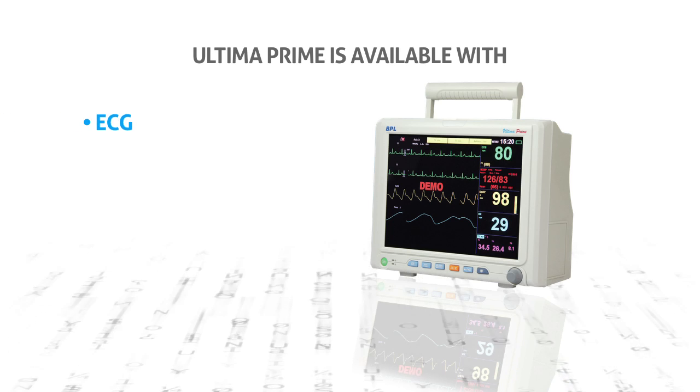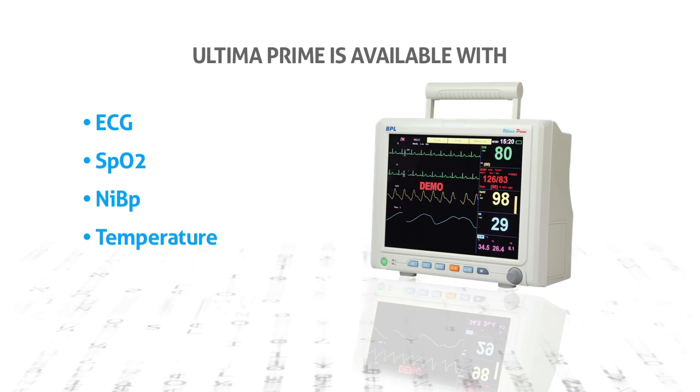Ultima Prime is available with standard configuration of ECG, SPO2, NIBP, temperature, and respiration.